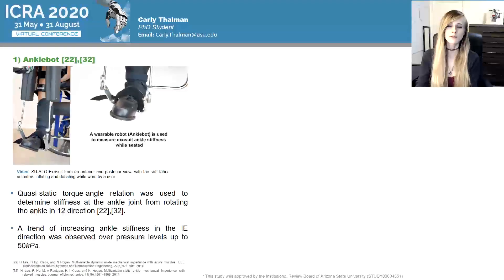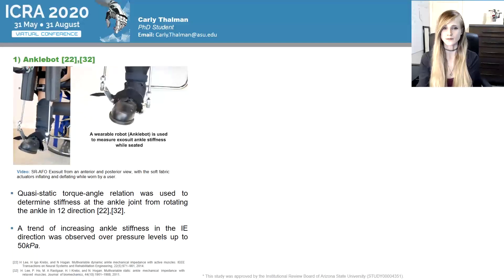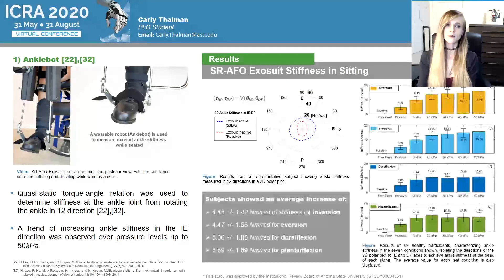The first condition was using the SR-AFO exosuit in a sitting position. A wearable robot, the Anklebot, was used to measure the 2D ankle stiffness in the sagittal and frontal planes. A quasi-static torque-angle relation determined the resulting stiffness of the ankle joint. A quasi-static test protocol was used to measure ankle stiffness in this 2D space and the effective ankle stiffness for each of the 12 directions and 12 movements was calculated from the continuous vector field presented in the 2D polar plot shown on the right. The results across all six users showed an increase in ankle stiffness in the IE directions following a trend with increasing pressure levels, while any slight increase in the DP direction did not follow the same trend.